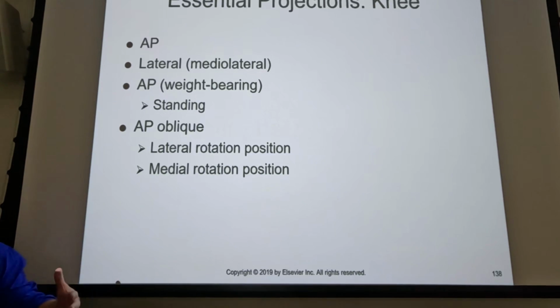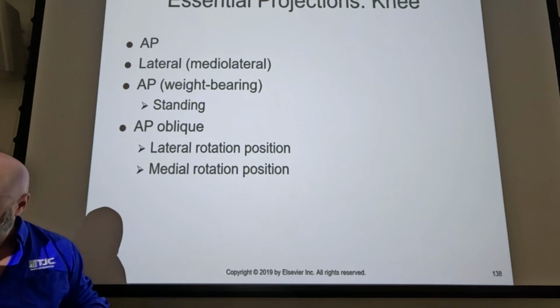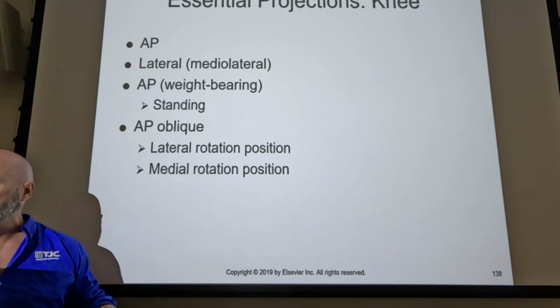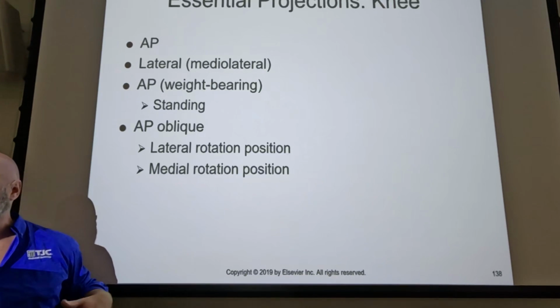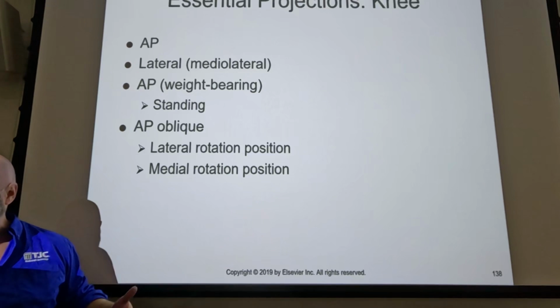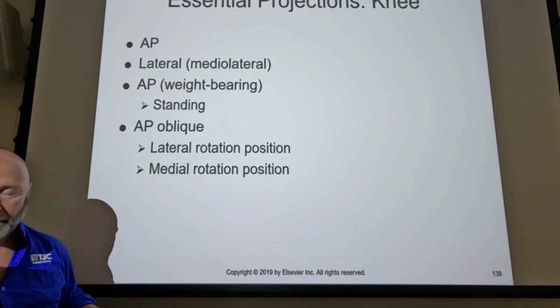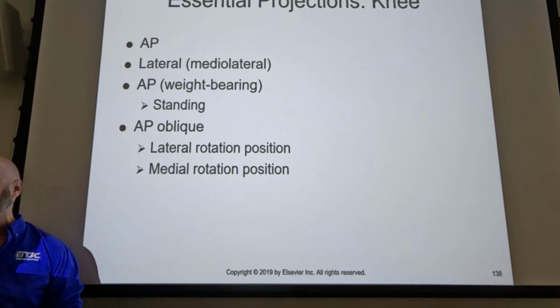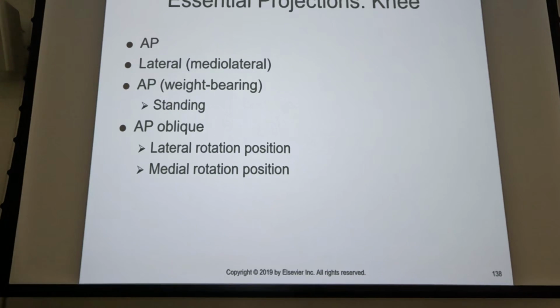You'll see this in some of the doctor's offices when you rotate out. They have a box with a slot in it so that you can put the image receptor down in the slot. The patient stands on that box, and you just shoot a lateral foot. It's just weight bearing. Their weight is provided by their body. They're not holding weights, it's just standing up. And it's weight bearing lateral to evaluate the longitudinal arch. That's really pretty much all you need to know about that.